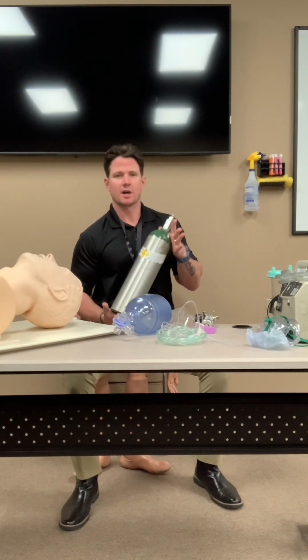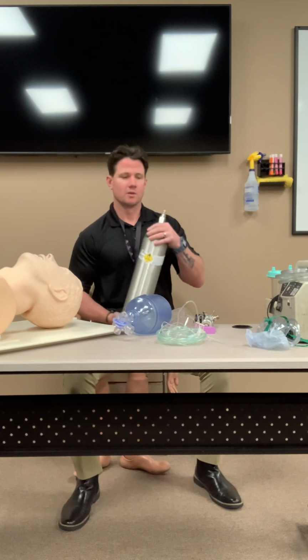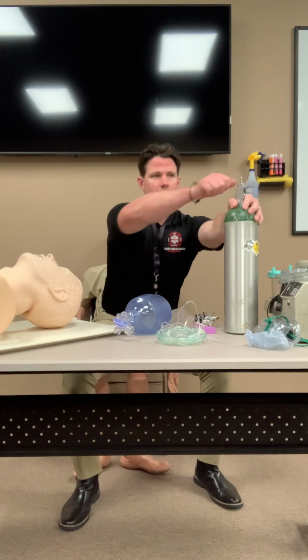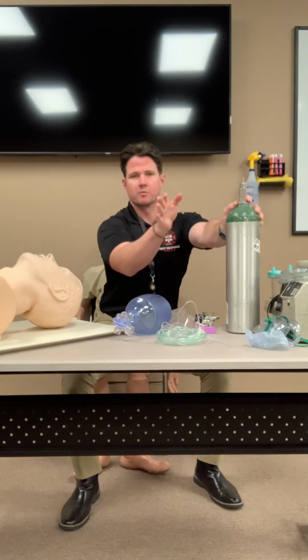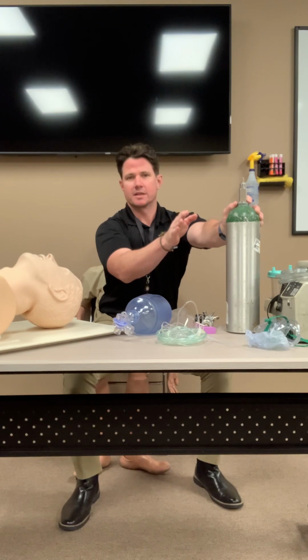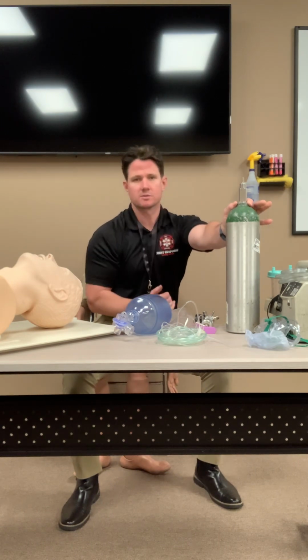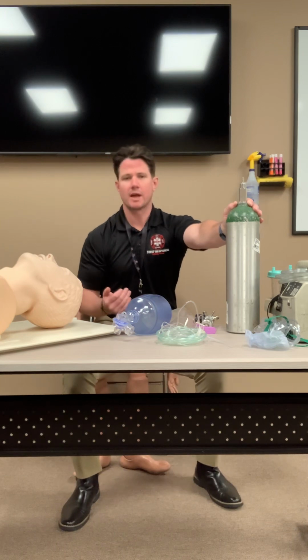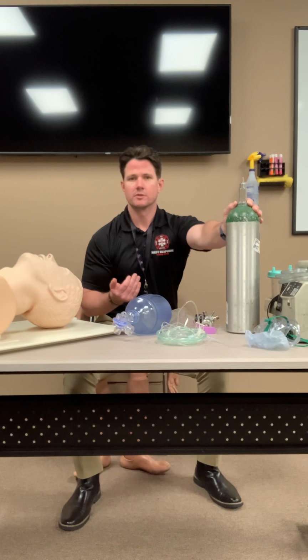Once you've inspected your oxygen tank, made sure it is oxygen, and made sure it's safe to operate with, we're going to crack open the valve stem just a little bit so we can blow out any debris if necessary. You may have an oxygen key, you may not. If not, just verbalize it. That's what we're going to do. As long as you verbalize it, we can say that it happened. That's how we know that you know the appropriate thing to do.